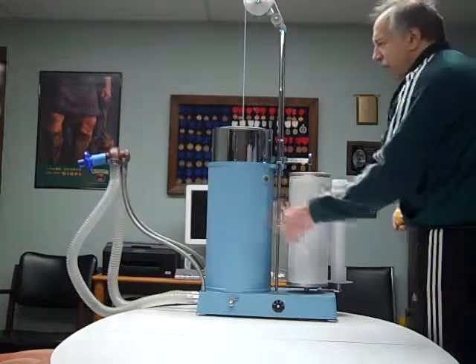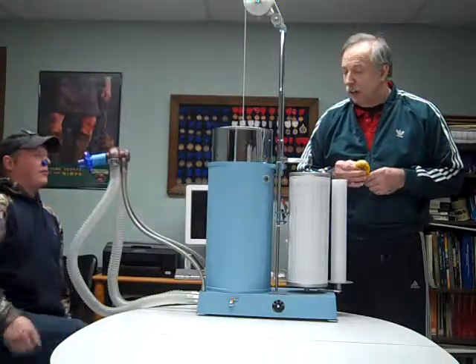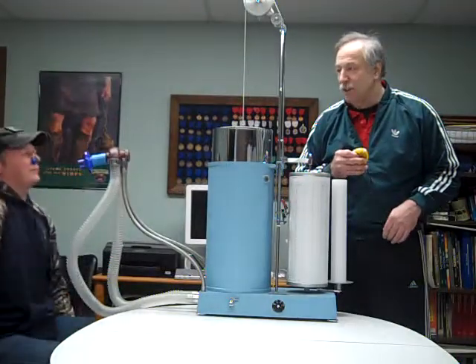All right, our next test — Chase will have a seat, and we're going to measure ventilatory muscle strength. This test is called a maximum voluntary ventilation test.